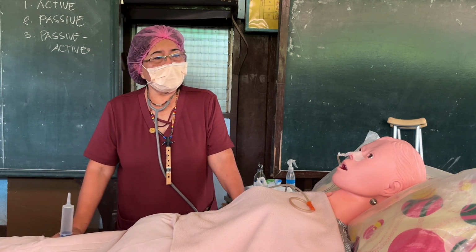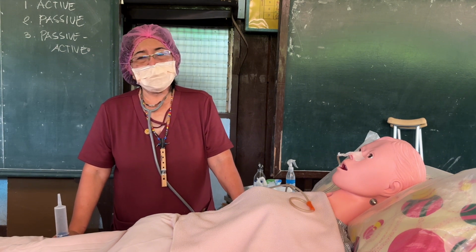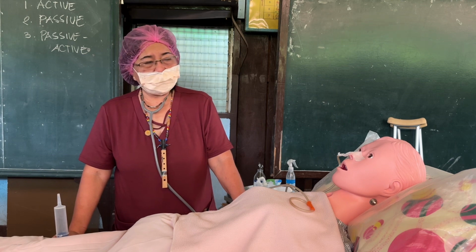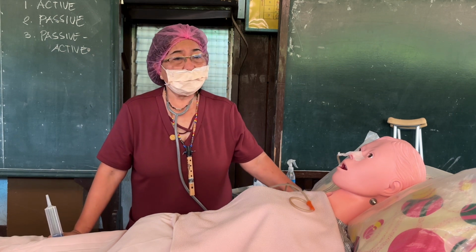Now, a question for you. How many cc of PNSS will be introduced? 1 liter. How many cc will we expect as the output, the return flow we are going to aspirate from the stomach? How many cc do you think?